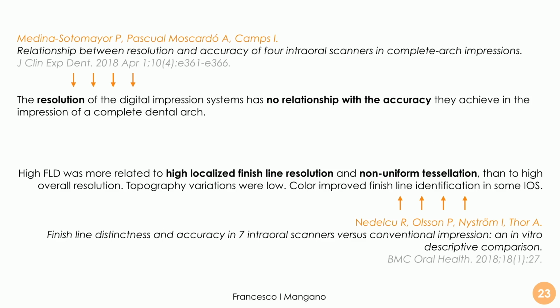And also, I mentioned it before, this very important paper by Nedelko and colleagues, published in 2018 in BMC Oral Health. They found that if the resolution of acquisition is high enough, adaptively, it's much better for the dental technician, because the dental technician can better visualize the margin line and then draw the margin of the restoration better without making any error.